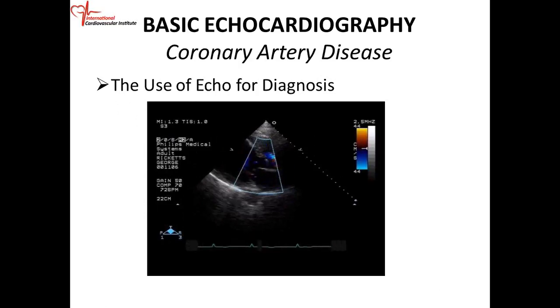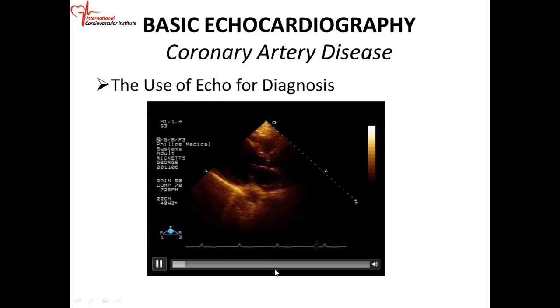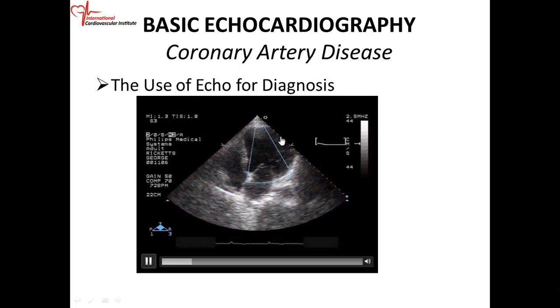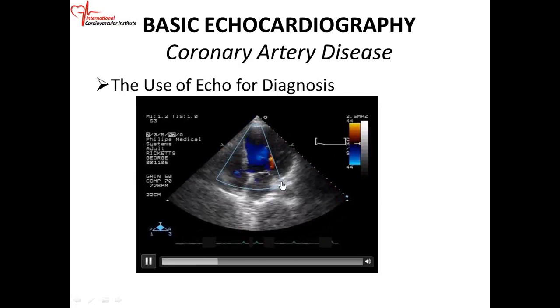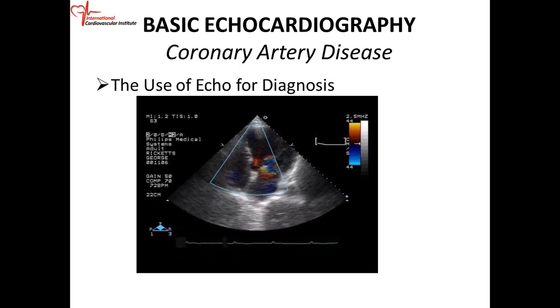When you see a patient like this with an ejection fraction that is pretty low, more than likely there are multiple blood vessels that are occluded. You can see, especially the apex is probably akinetic, but the whole thing is hypokinetic. So coronary artery disease is one of the most common causes for this.